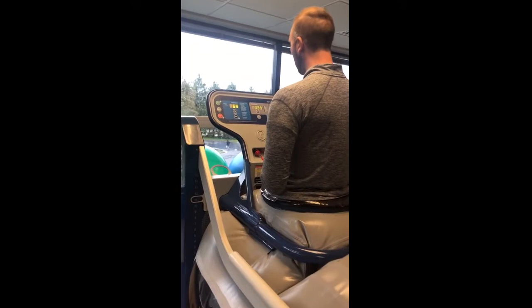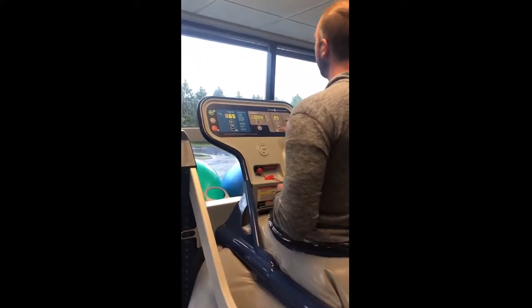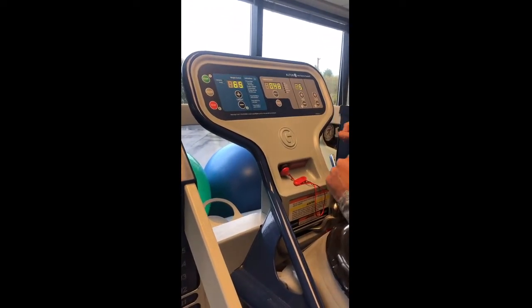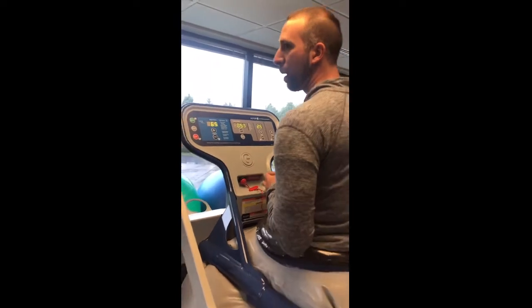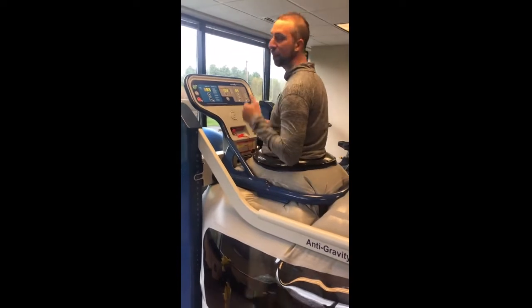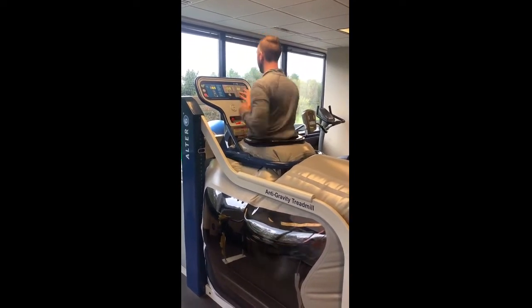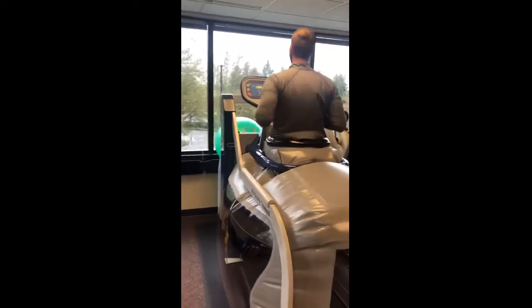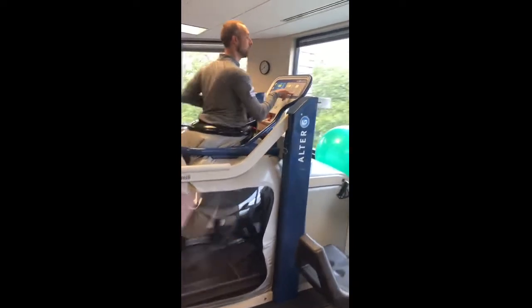Now we can start the treadmill belt with normal walking. The treadmill has speed control and also an incline that we can take up or down. In a normal walking scenario, we usually have people walk for a couple of minutes and then take the speed up. If someone's having pain, we'll usually lower their body weight down even more. Right now I'm running at about 7 miles an hour at 65% of my body weight. Another nice thing about the Alter-G is that it's clear around the sides, so therapists can watch you, video you, and look at what your gait mechanics look like.